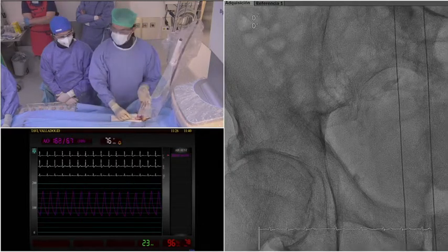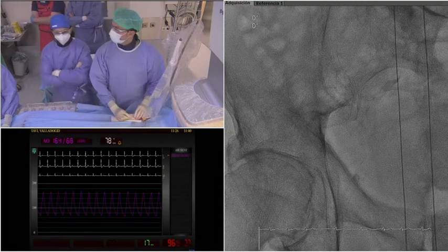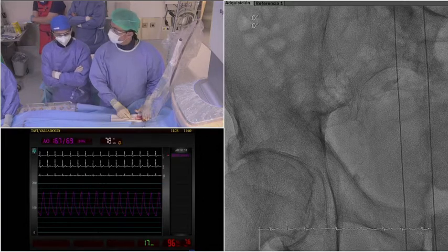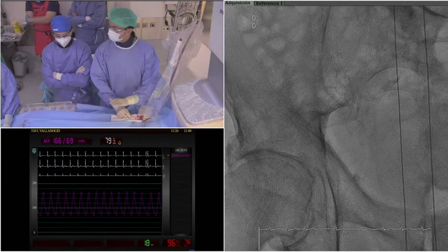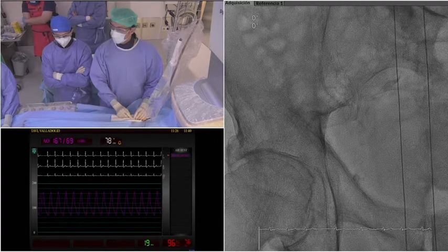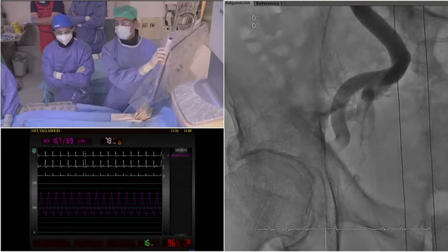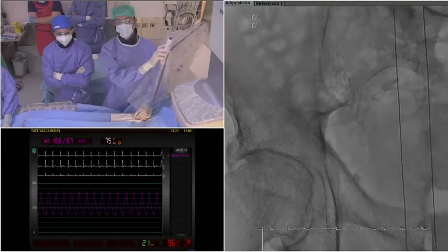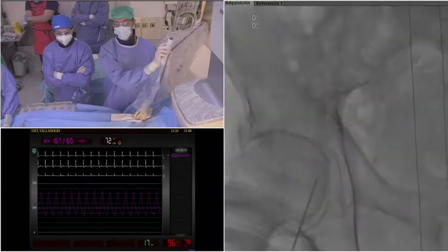So the setting is we are with conscious sedation, the patient is awake. We have a left radial artery where we guided our puncture and a right femoral where we'll do our TAVI procedure. We don't have yet the Python introducer in place. We will show you how it works in this patient. As you can see in the angio, and you saw in CT, it's very tortuous, the iliac and femoral axis. There is some calcification down there at the mid-level of the femoral head.